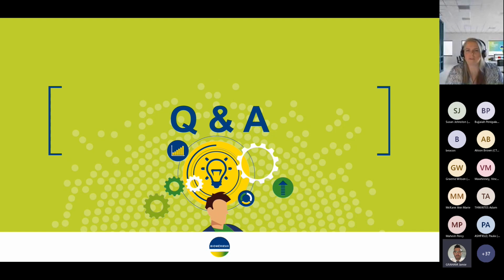I'm not an expert on breakpoints, and this is an incredibly complex area. As I'm sure lots of you know, if we had very specific questions about that, I would have to direct that to the application specialist team. But what I'll say is that it's not for duplication. You can manage all of your breakpoints methods for all manual methods within MAESTRIA.